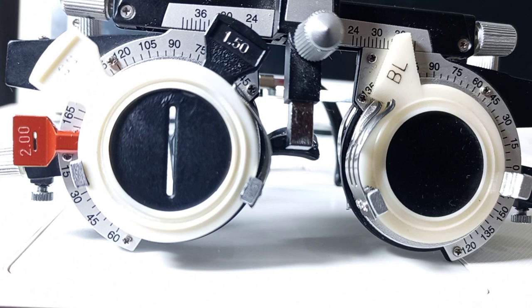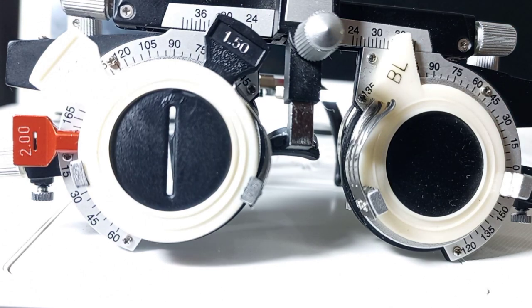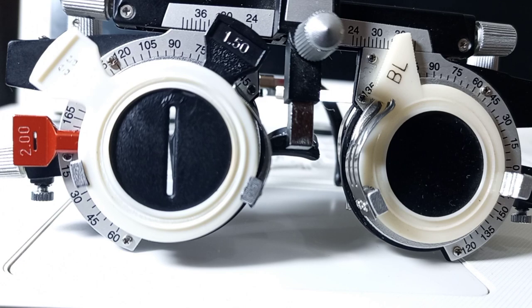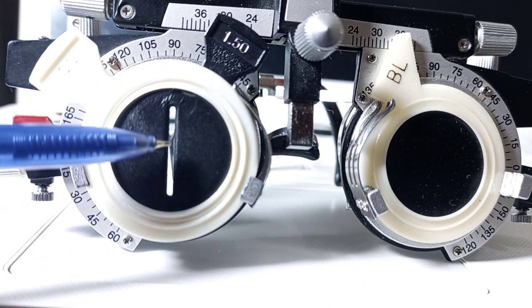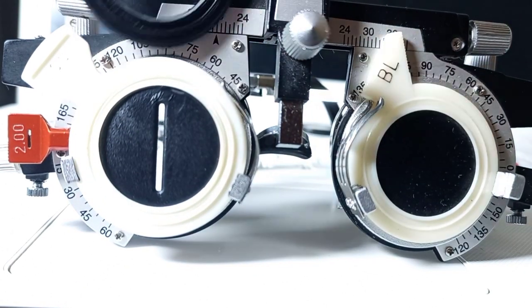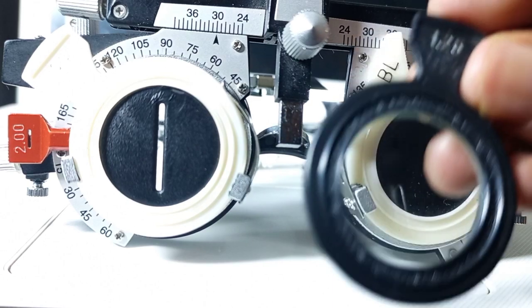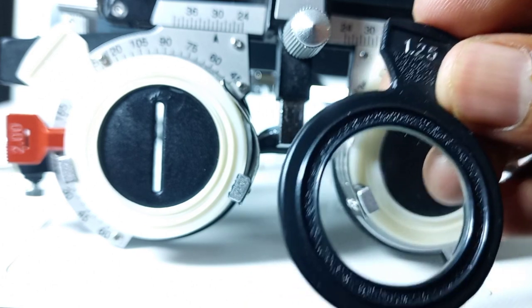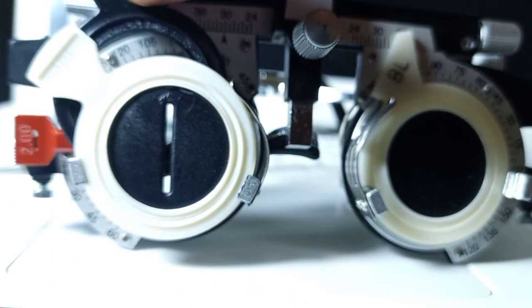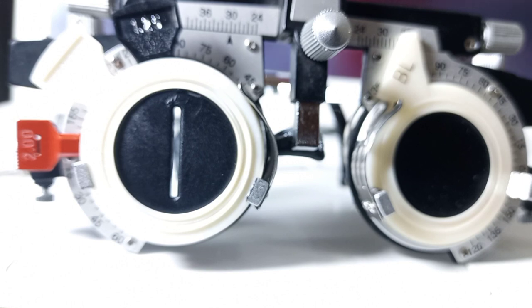Now we will gradually reduce the fogging lenses. Right now the power of our fogging lenses is plus 1.50. We will keep the stenopic slit in place at 90 degrees and reduce the fogging lenses by plus 0.25 steps. I will place plus 1.25 spherical as fogging lenses, reducing the fog by plus 0.25. We ask the patient whether the visual acuity is getting better.